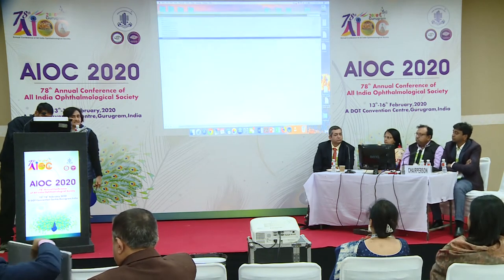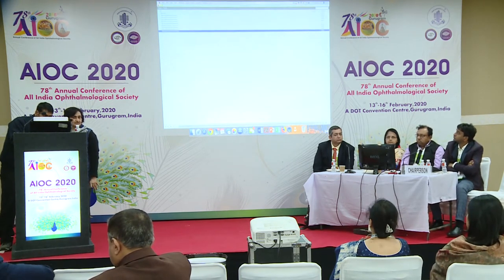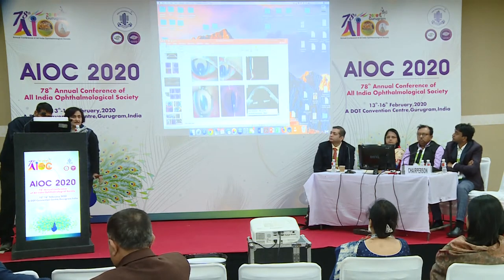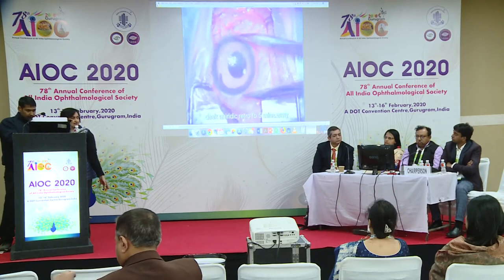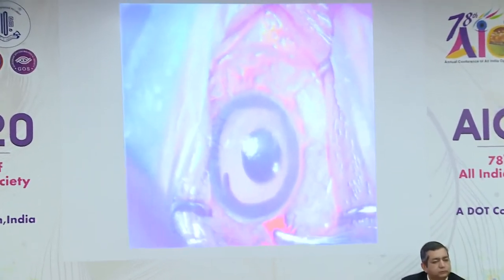The second case I'm going to show is where I did DSEK in a case of PBK with an IOL which was malpositioned, with the haptic in front of the iris. And the third video is a case of trauma. This is a case I'm trying to show you.